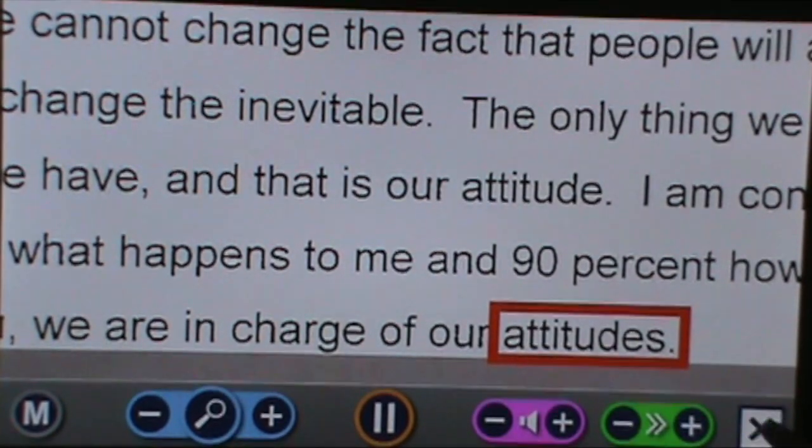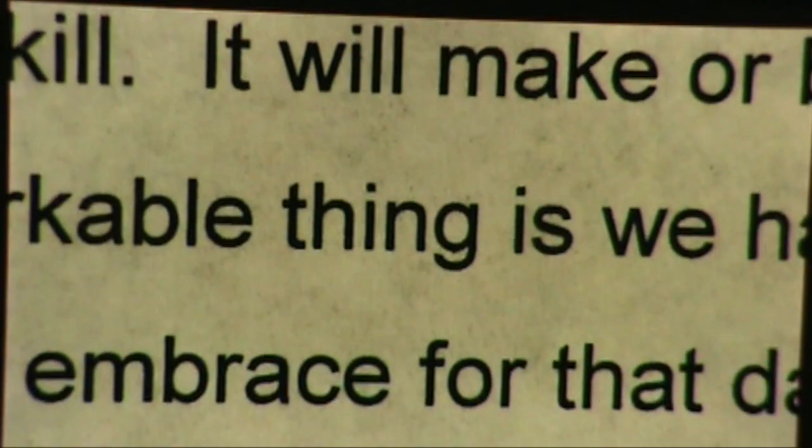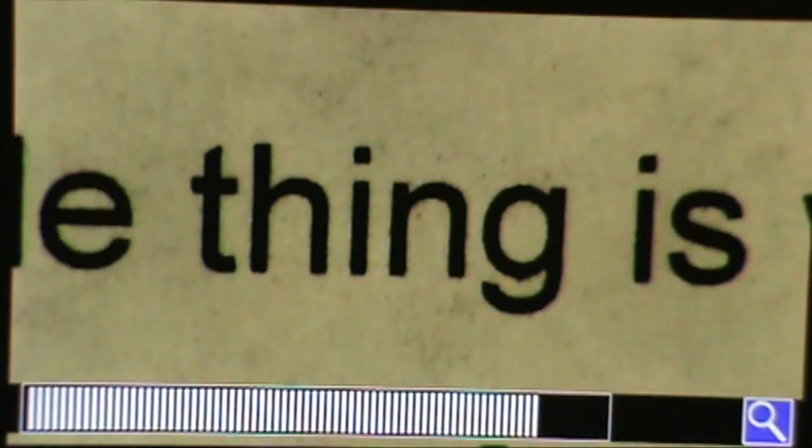Excellent. So that's the document by Charles Swindoll, and that's a document that I use a lot to demonstrate. Again, just another demonstration of what this may look like in the natural mode. And because this was printed on a laser printer, let's see if we can actually see on here. You know, the printer does a good job of printing. These characters are very strong. But you can see that the text is slightly blurry here, isn't it?